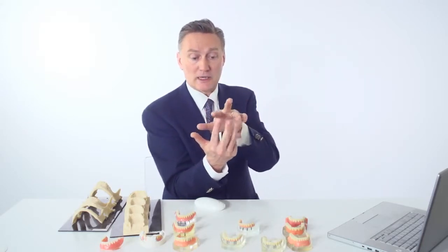So if you're missing one tooth, yes, you do need one implant. But if you're missing three teeth, you could actually do two implants and just do a bridge in between. You'll see some of the examples of this.